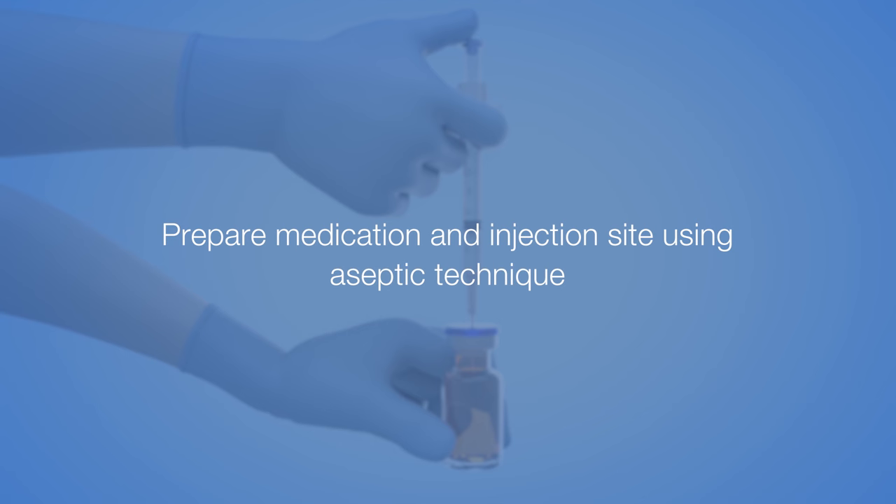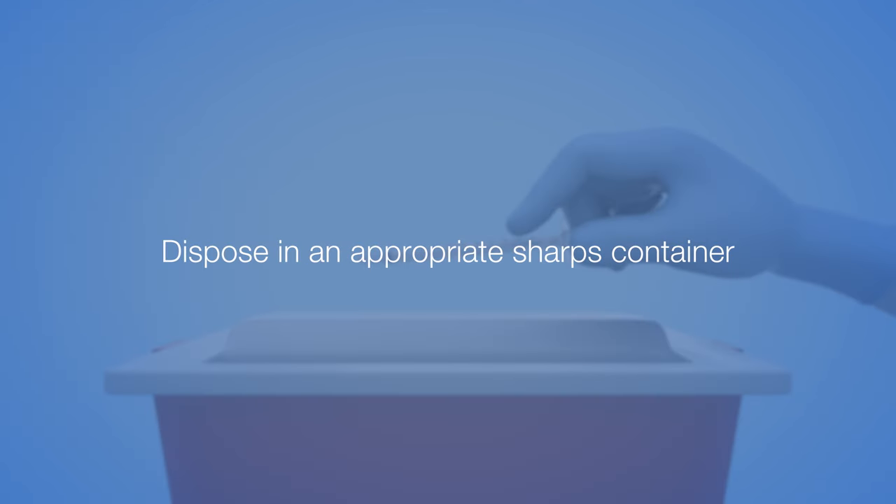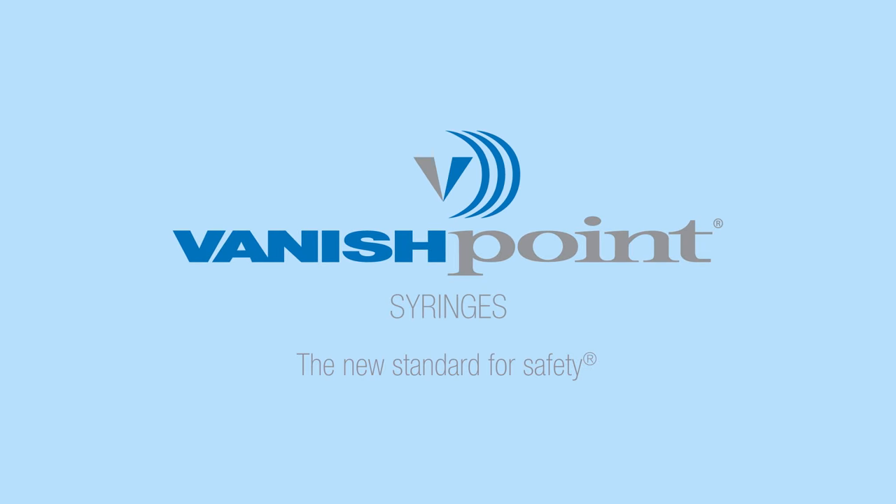Prepare medication and injection site using aseptic technique. Fully depress the plunger with your thumb to give the full dose and activate the retraction mechanism while the needle is still in the patient. Dispose in an appropriate sharps container. Vanish Point Syringes — the new standard for safety.